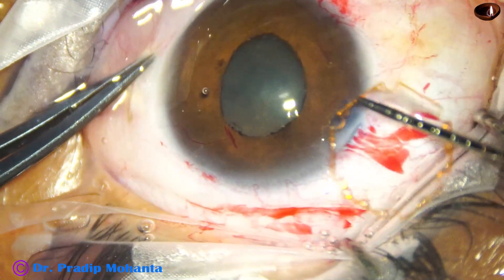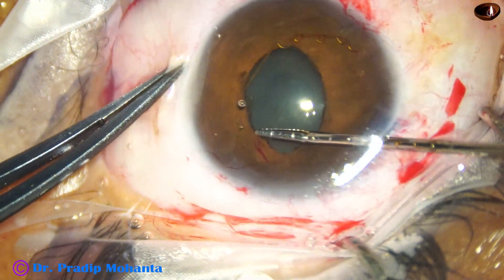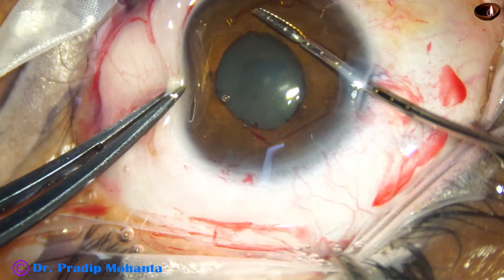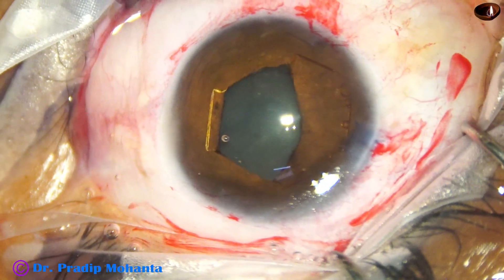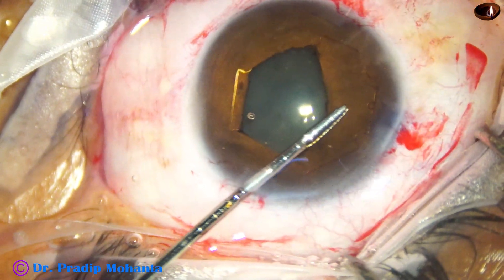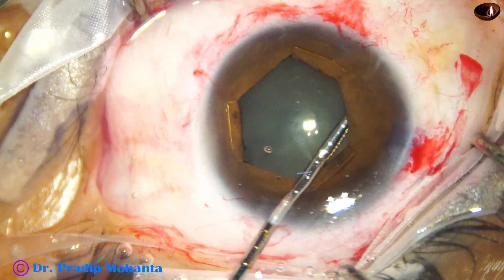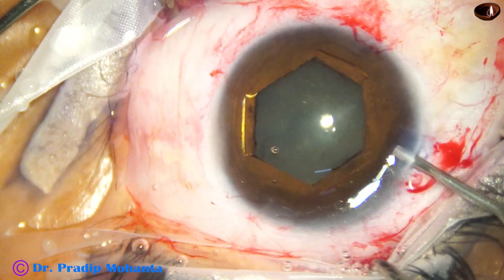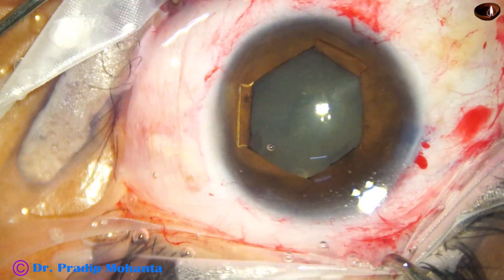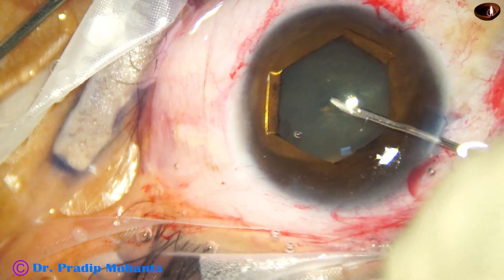B-hex has come out with other designs for manual small incision cataract surgeries and for PHACO also, with larger expansion of the pupil. We are going to use that in future in the coming days. As you see, it has flanges and notches. Three flanges have gone under the iris and three flanges are above. The flanges with tabs are under the iris, and the middle tab is held and it is placed using 23G B-hex forceps.